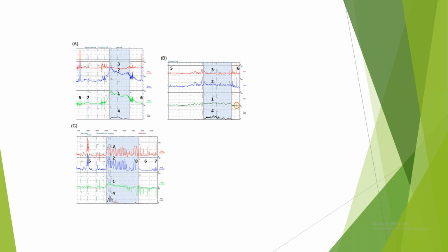So, Doctor, the C will be voiding difficulty. It's showing voiding difficulty. All three I am showing are voiding difficulties. I will send you the recording afterwards. But all three that I am telling right now are voiding dysfunction only.